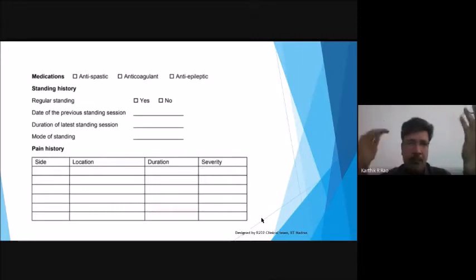If the person is not able to feel the pain, then the person is more prone to developing pressure sores. So that is something that we would also want to know. And the other extreme is if the person has pain and is not in a position to use the wheelchair. If it is very severe, or interfering with the ability to sit or stand, then a wheelchair may not be recommended at that point of time.